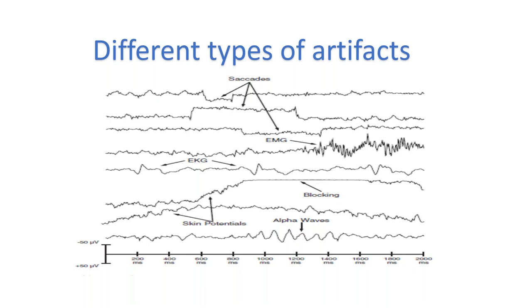We had artifacts like sawtooth waves. Have you experienced those? Was it the saccadic movement of the eyes you had? Maybe yours also look a bit like that, but those are very regular. Sometimes on the small screen they look large, and there are only two or three. When you think of the VOR, that is how you get a sawtooth thing. If the ocular reflexes, the ocular potentials, are affecting the recording, then you get this sawtooth.